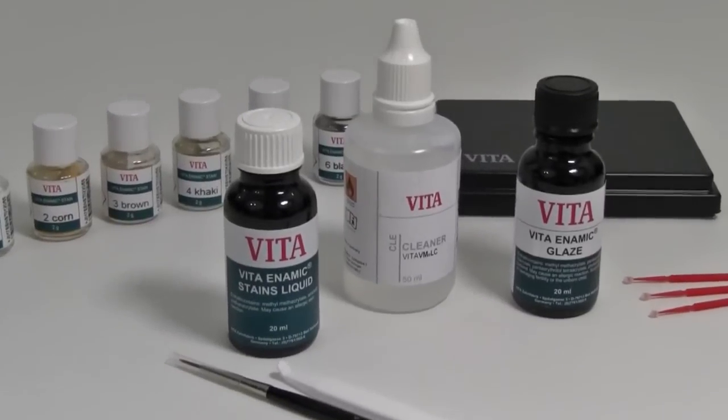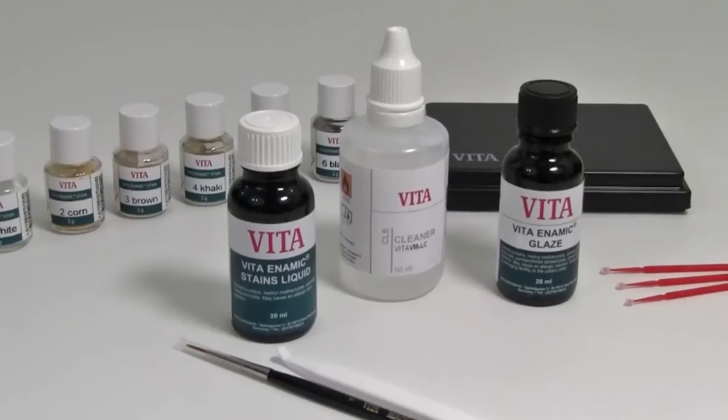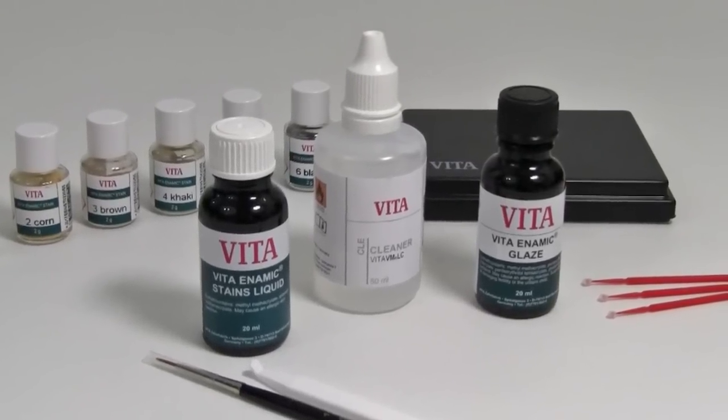There are three individual liquid bottles included in the Enamex stain kit. One: the VM-LC cleaning solution. Two: the Enamex stain liquid. And three: the Enamex glaze liquid.